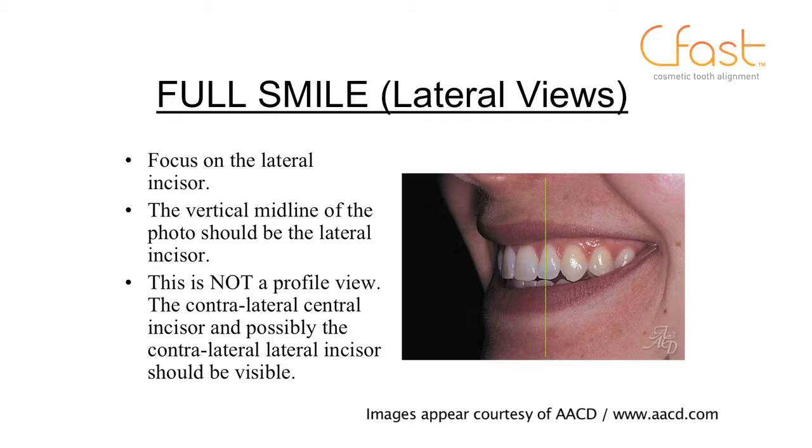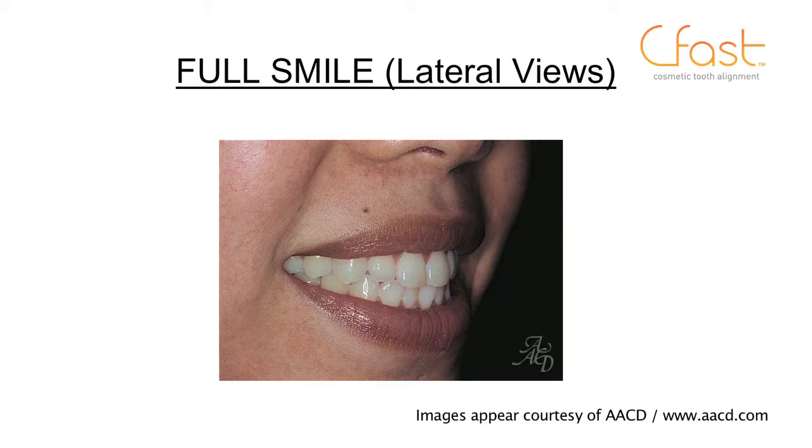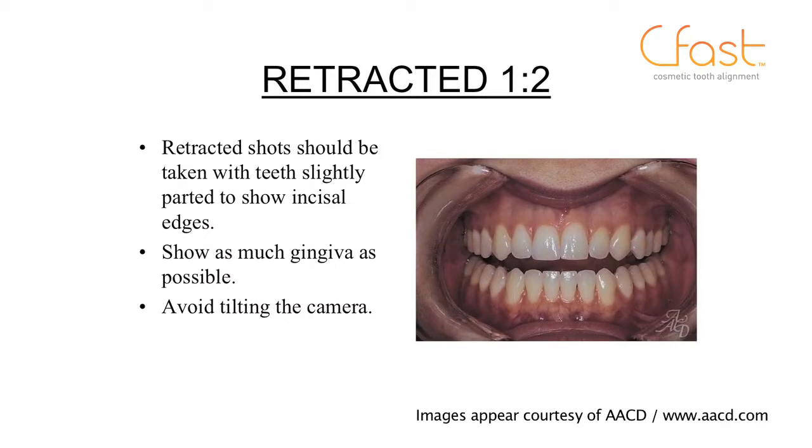Orthodontically, yes, we can take a side view, but that would be more for comprehensive orthodontics rather than for the aesthetic orthodontics or cosmetic orthodontics that Cfast is more related to. And so here we can see another example of that view, and we'll take that from the left and the right. So now we'll have our cheek retractors.